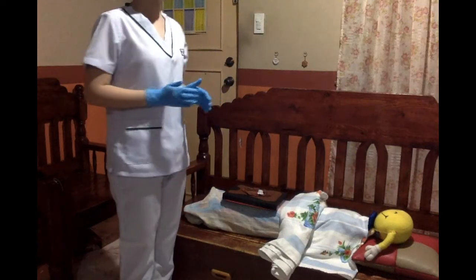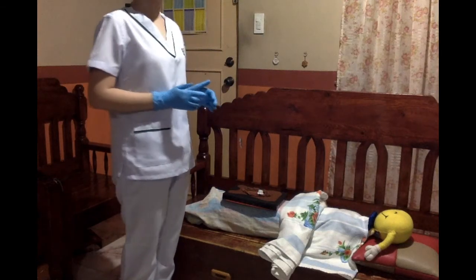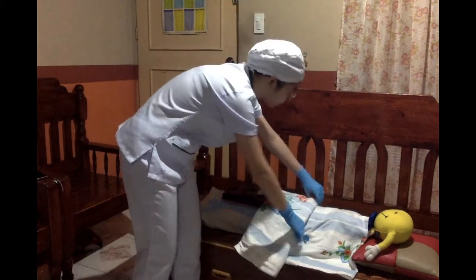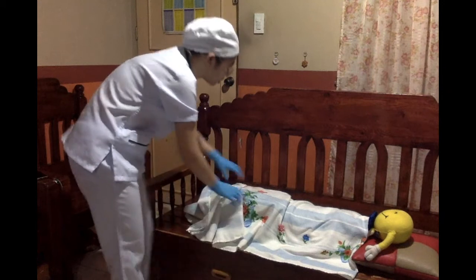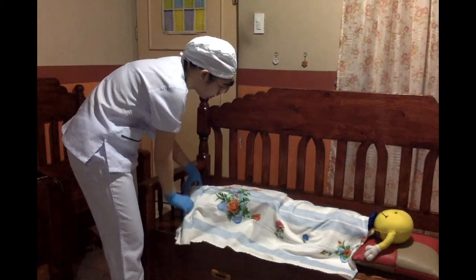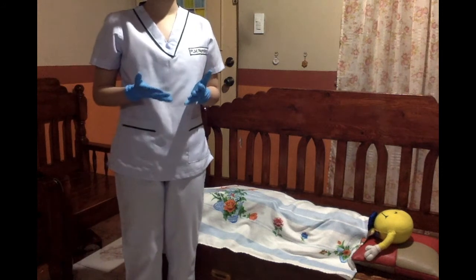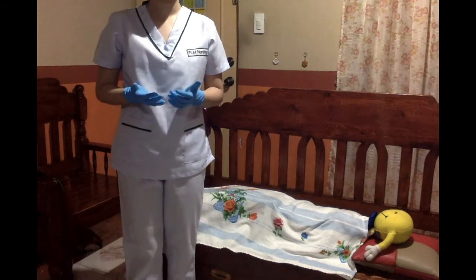The client will remain in the dorsal recumbent position to further expose the labia. Then I will drape the client to provide privacy and reduce embarrassment. After that, I will now discard my gloves and perform hand hygiene to reduce microorganism transfer.